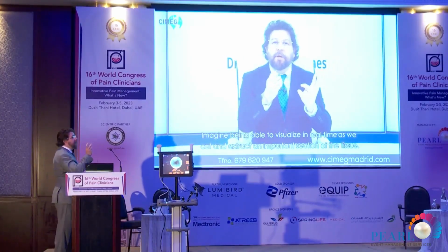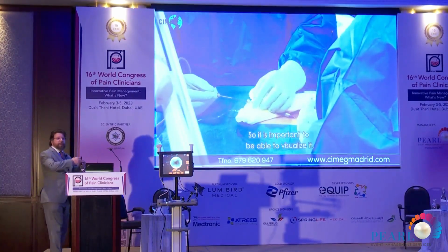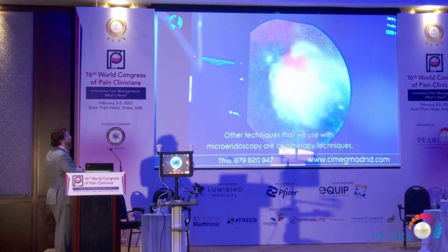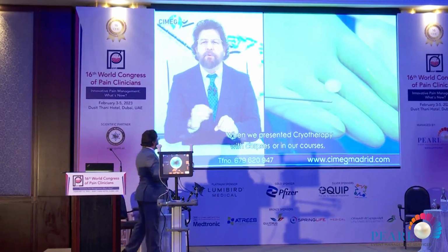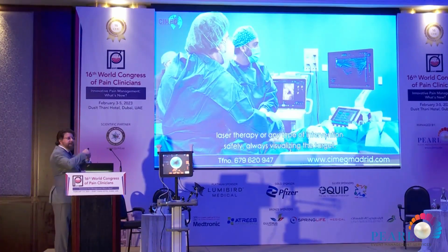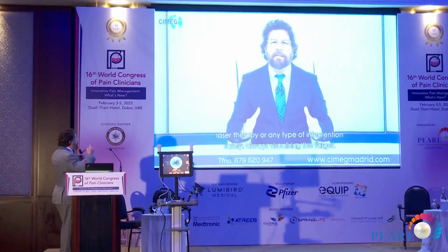Imagine that if you have one scar, you may have one entrapment of the nerve, or maybe a problem of traction in the muscle or in the nerve, and you need to evaluate it after. In my case, I use elastography, a quantitative elastography, and I use cryotherapy to look at what happens when you use it. It's possible to see the ice ball around the nerve, and this is good for us because you can see exactly the site of the target.